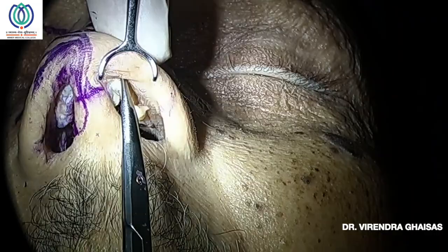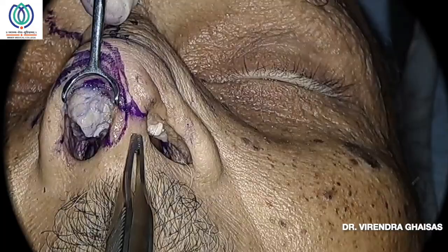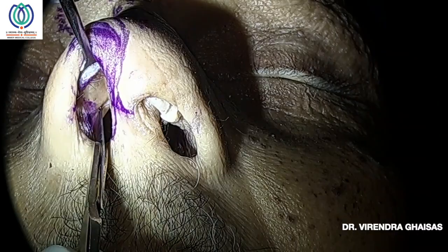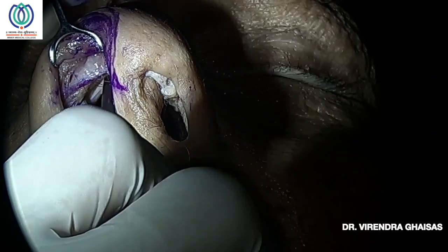You can see the dome of the lower lateral cartilage of the right side and the left side too. You can deliver it without taking an intercartilaginous incision when the skin is loose. But it's advisable to take an incision at the lower border of the upper lateral cartilage so that the scroll area becomes free. And you can deliver this lower lateral cartilage in a closed rhinoplasty approach.